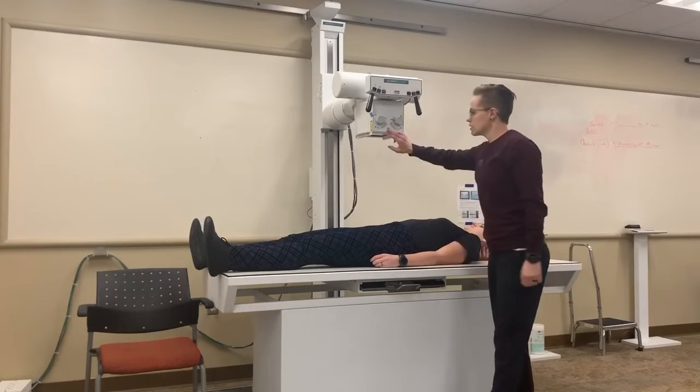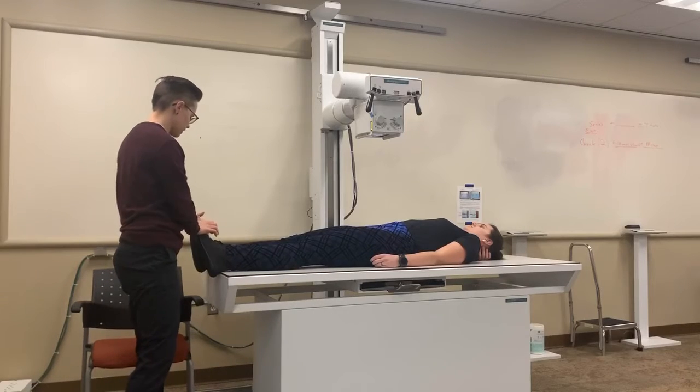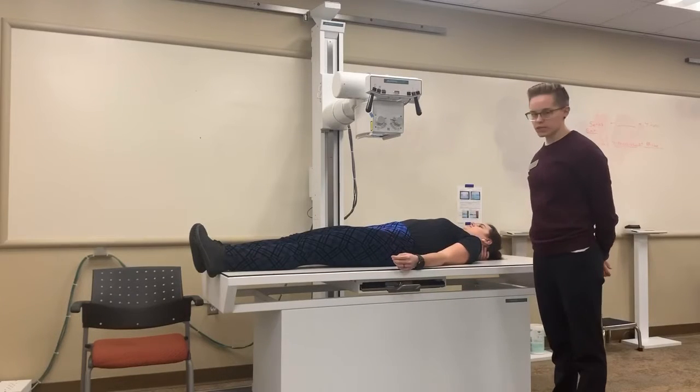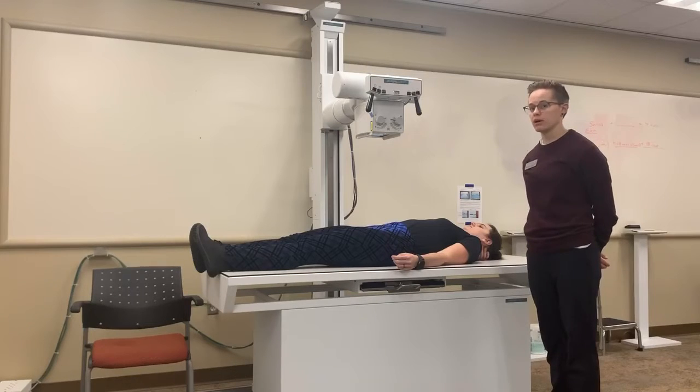No tube tilt. You have to internally rotate your patient's feet approximately 15 degrees, so have them touch the big toes. Their arms out of the way. Don't breathe, don't move. No filter, no shield. That's A to P pelvis.